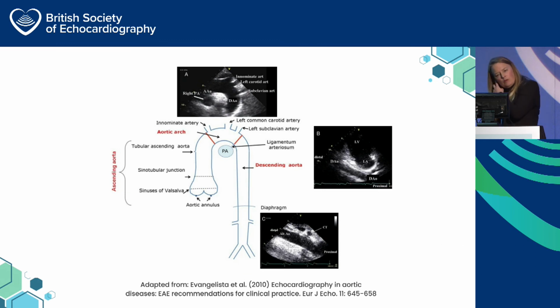And then finally about the aorta, just to encourage you to not forget about the other views that you can see the aorta in. Actually in the parasternal long axis view, don't forget that you can see the descending thoracic aorta behind your standard parasternal long axis view, behind your left atrium. Sometimes you can see that it's dilated there. You could have a right parasternal view, but you should be doing a suprasternal view in everyone, okay? So get familiar with that.